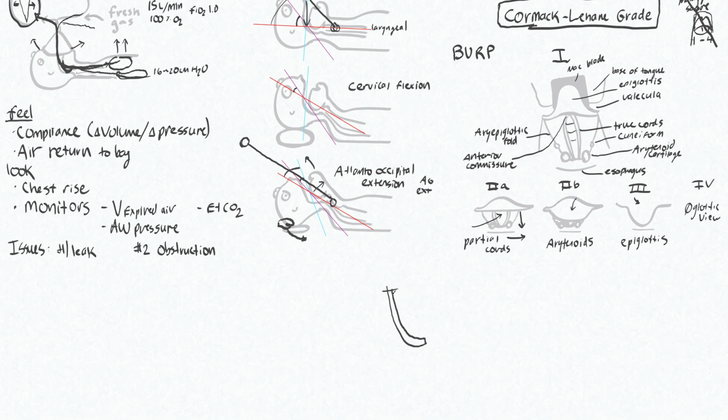So this is your endotracheal tube. It'll have its connector up top, and a cuff here with somewhere to inflate your cuff. I'm going to hold this about 2/3 of the way up, or closer to the top than the bottom, so that you don't have to change position of where you're holding this when you insert it to an appropriate depth. And that depth for men is about 23 centimeters. And tube should be about 21 centimeters for women. Of course, different heights of people.